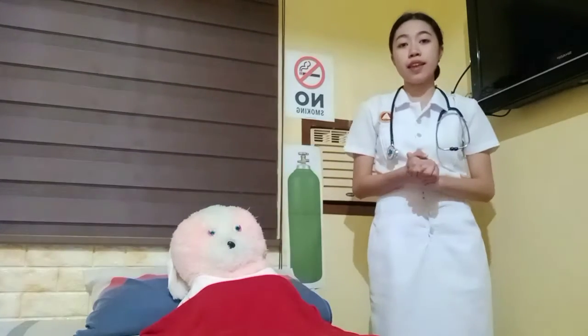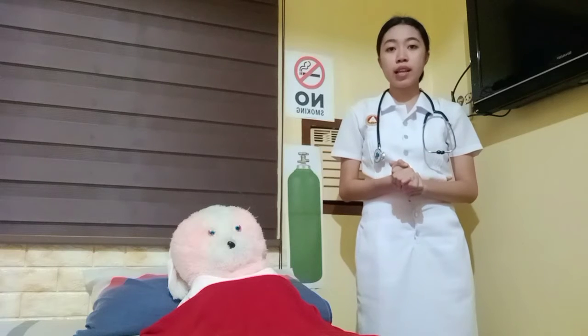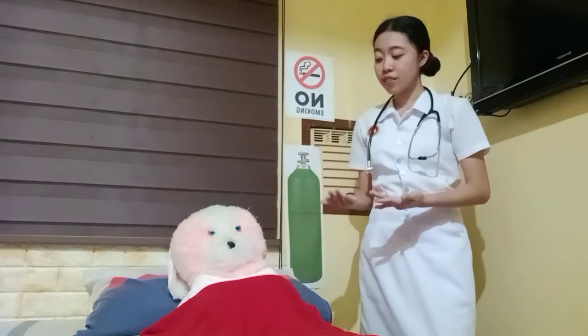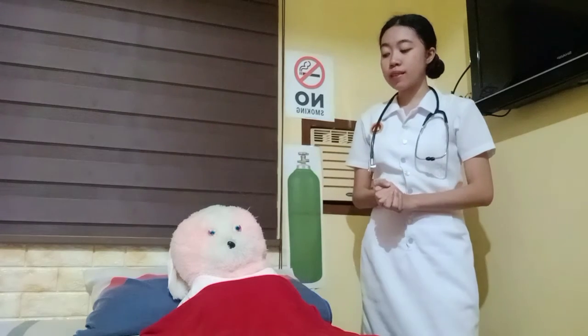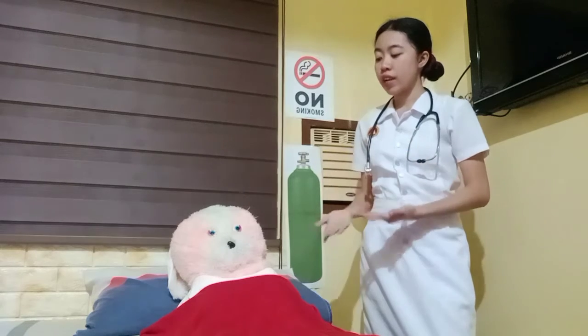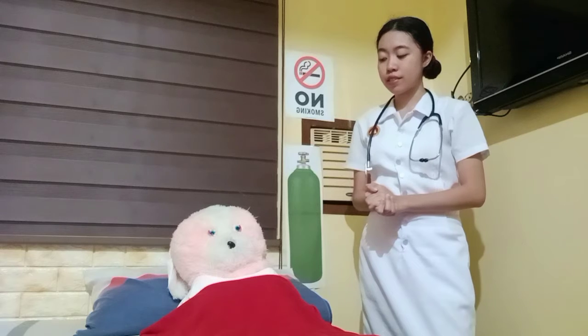Okay, and then after that, explain the procedure to the client. Explain that the oxygen will ease dyspnea and discomfort, and inform the client concerning safety precautions associated with oxygen use. Okay, ma'am, so oxygen helps to ease dyspnea and discomfort. So remember that you cannot change the flow rate on your own because this may lead to serious side effects. And please refrain from smoking to avoid fire hazards. Okay?